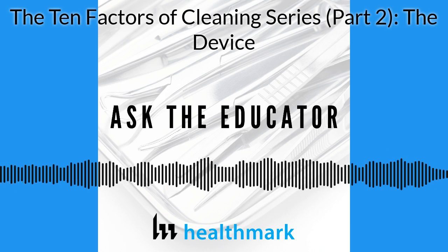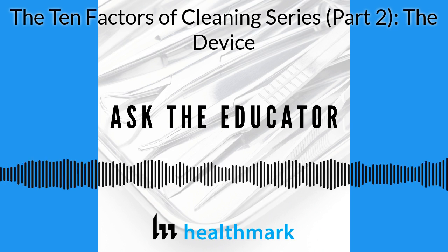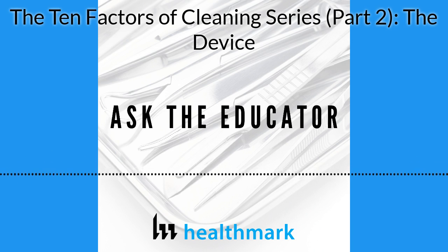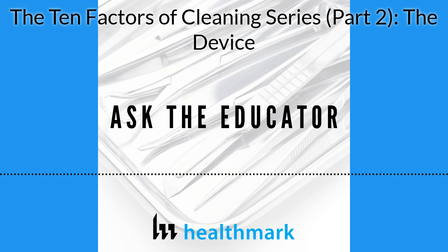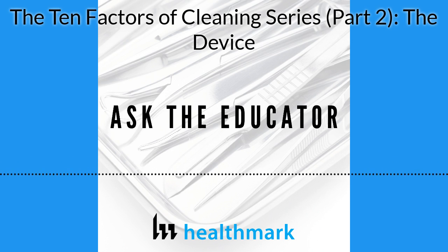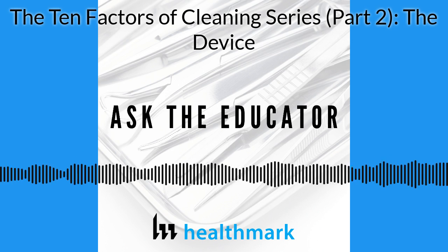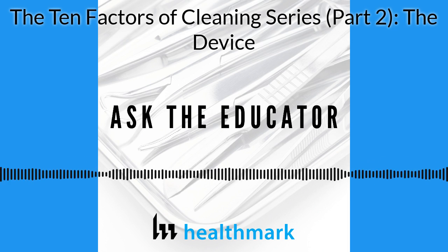I was talking to the vendors of multiple different instrument companies, and I said, look, it's going to have to be an instrument that is approved to be sterilized while it's in the put-together position. It can't be only sterilized with all the components separate, because I know my OR and I know they're going to have a hard time with it. And it's just another group of people that will have to train on it.